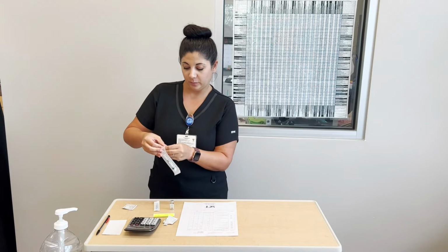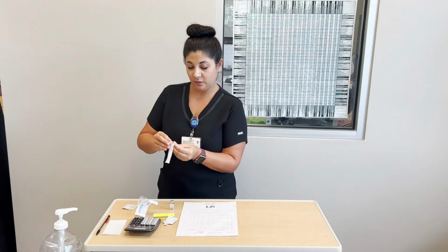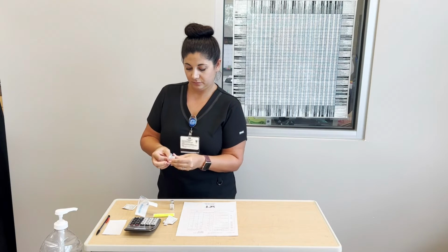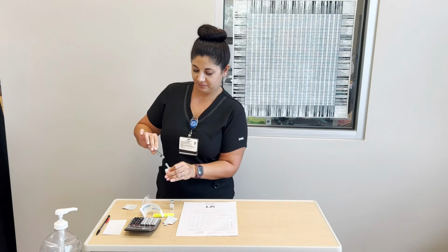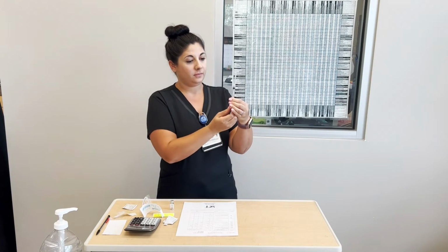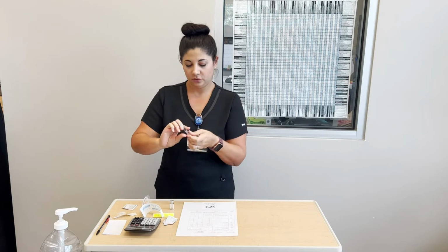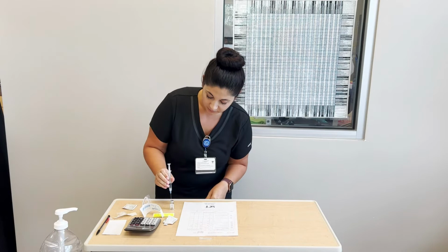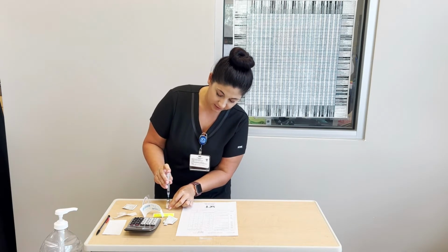While that dries, I will get my syringe and my needle ready, maintaining sterility the whole time I'm opening these. Going to add 1 milliliter of air to my syringe. Go right through the center and inject the air into the air in the vial.